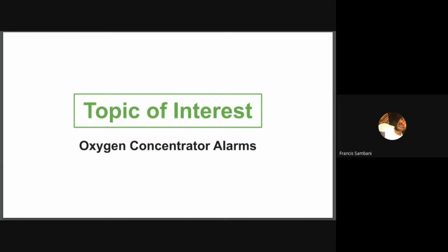So firstly, we'll look at the definition of an alarm. An alarm is a warning and/or an audio alert representing the possibility of harm, and that harm can be either to the operator or the unit itself. Medical devices have alarms, and these alarms are intended to keep the patient safe by alerting nurses to potential problems. And oxygen concentrators have a lot of alarms which have specific characteristics.